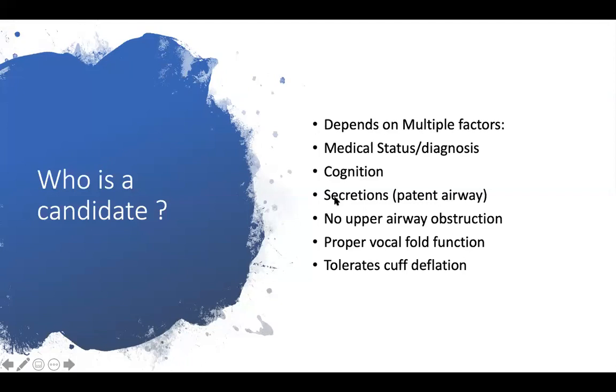Cognition. If the patient is not alert, or is very anxious and unable to follow commands, then the patient is not a candidate, because they need to understand what you are doing and they need to express if they feel any discomfort when you put the speaking valve on.